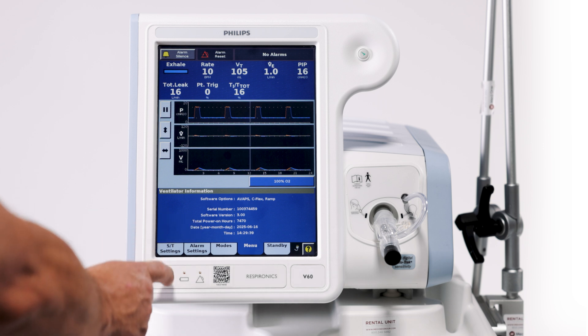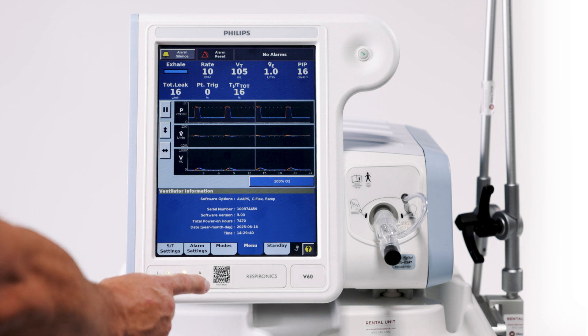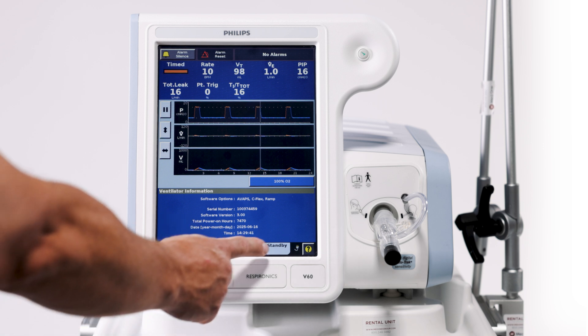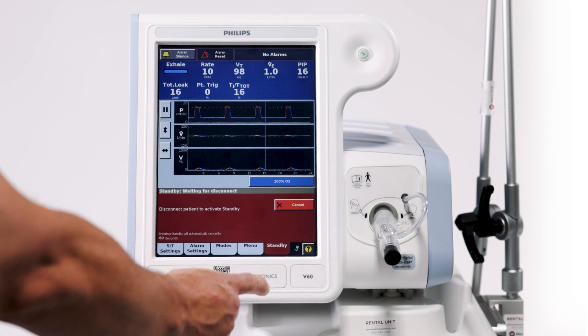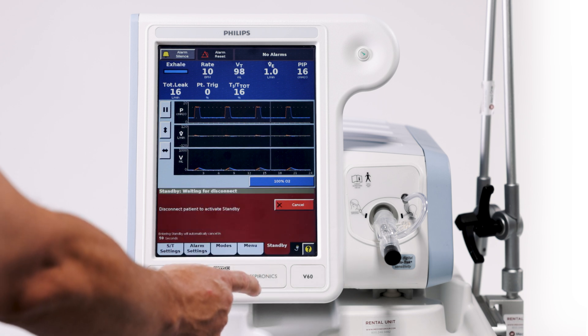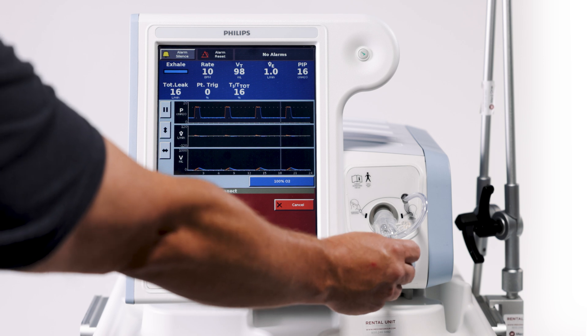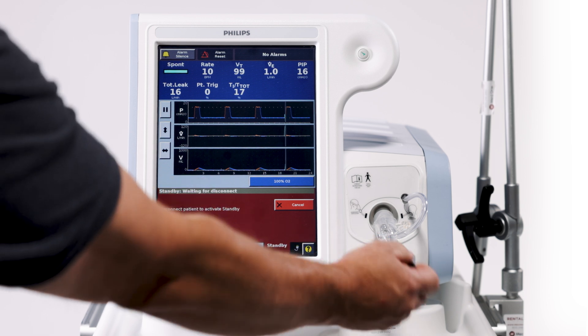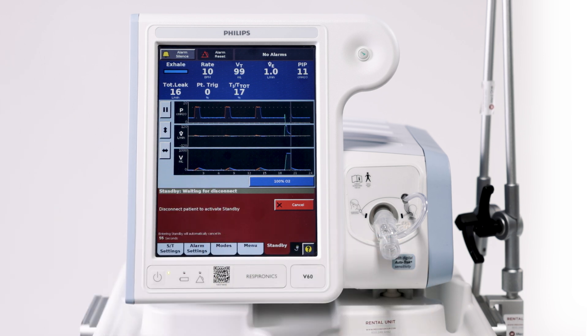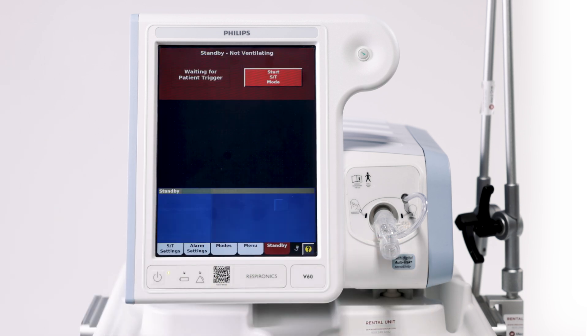To put this ventilator in standby mode, we're going to select standby. We're going to disconnect our patient and it'll return to standby mode.